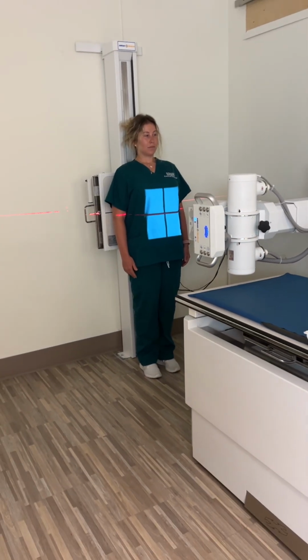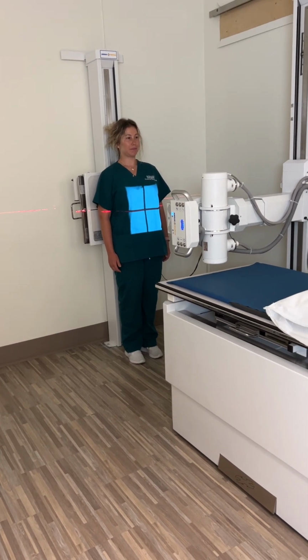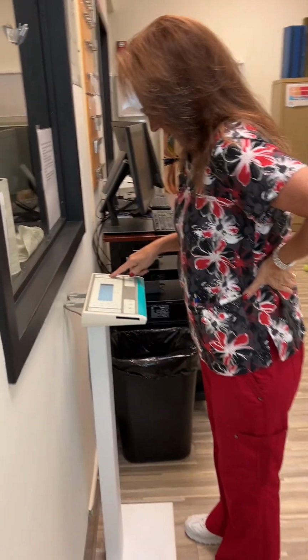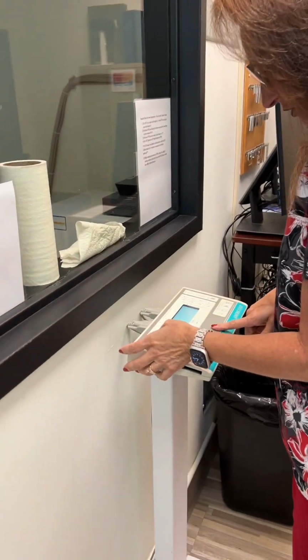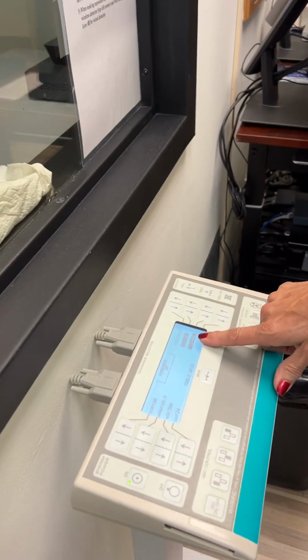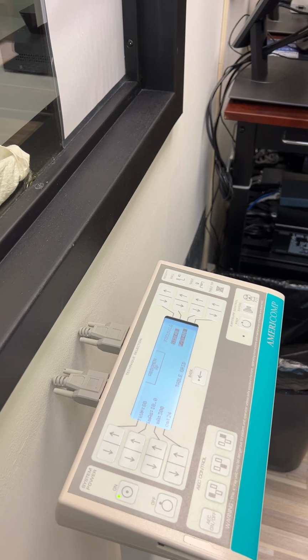Blow it all out. Hold it out, don't breathe. Beep, good, you can breathe and relax. And now what we are going to do is set this to the table Bucky, 40-inch SID, 80 at 10, and we're gonna do a supine abdomen.